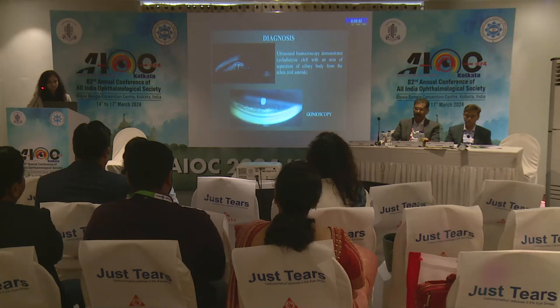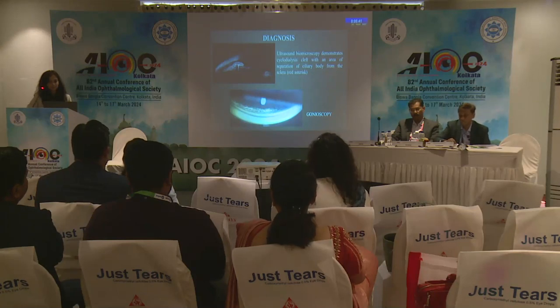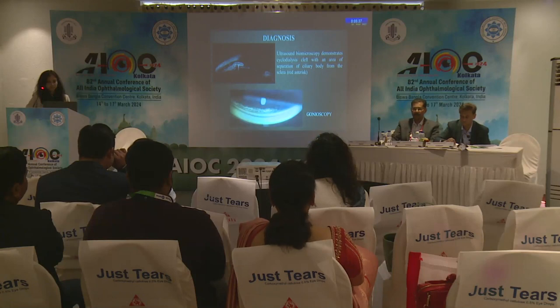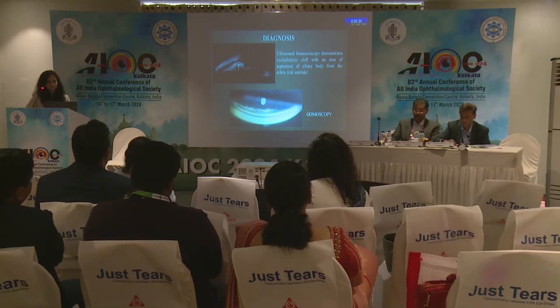Success of cleft repair surgeries is primarily dependent on the right localization and accurate estimation of the extent and number of clefts. Hence, acquiring skills of preoperative and intraoperative gonioscopy and ultrasound biomicroscopy are mandatory. Preoperative ultrasound biomicroscopy, especially by the dynamic protocol, increases the chances of identification and objective quantification of the cleft.